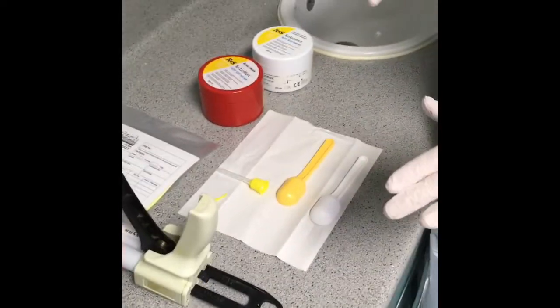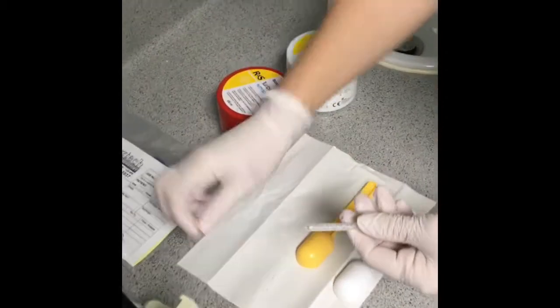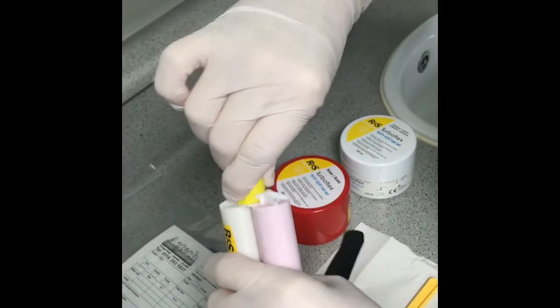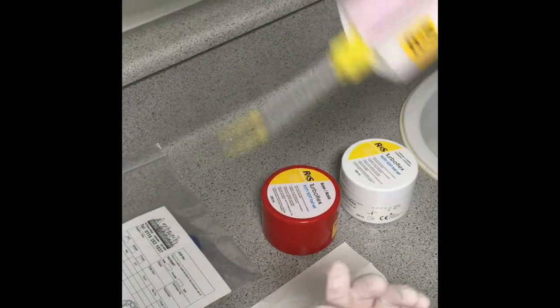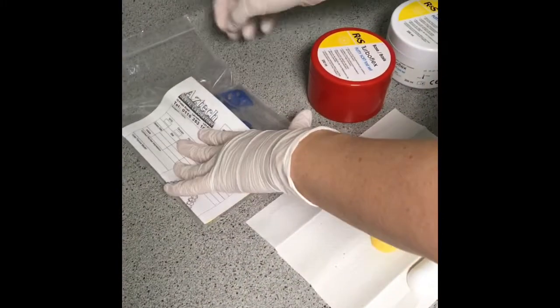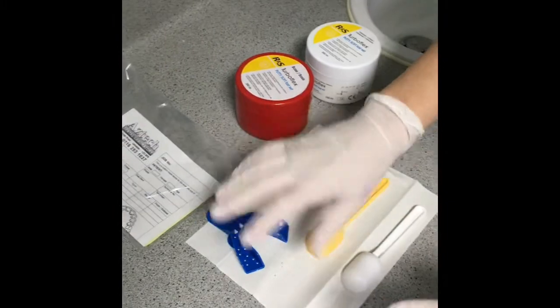For a crown preparation you need your putty, your wash, a long tip and a short tip. Connect the tips together, remove the lid, twist to adjust — turn it up for an upper tooth so the dentist doesn't have to move their arm around, or hold it differently for a lower tooth. Set that up on the dentist's side. You'll also need your lab ticket, your bag, and the tray — adhesive should already be applied to the tray.